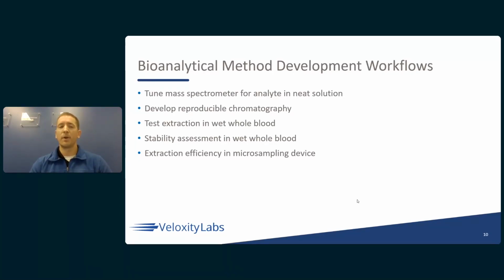And then here's a big one that's often overlooked, is doing stability assessments in the wet whole blood. There's going to be a period of time that blood takes to dry from wet to dry after it's collected and processed. So you're going to want to ensure that analyte does not degrade during that process, or that will throw off the results. And then the biggest one, in my opinion, is extraction efficiency. There are several variables here to make sure we're actually extracting the drug off of these devices, as opposed to maybe just crashing them out with an organic solvent. We're pulling these off. With that comes a lot of variables.